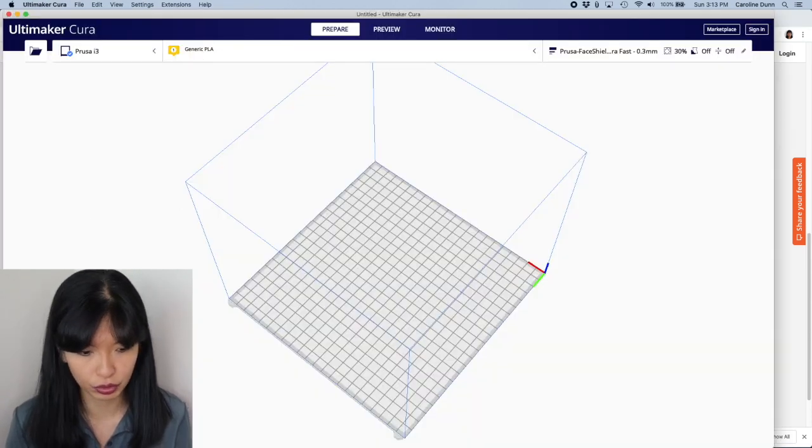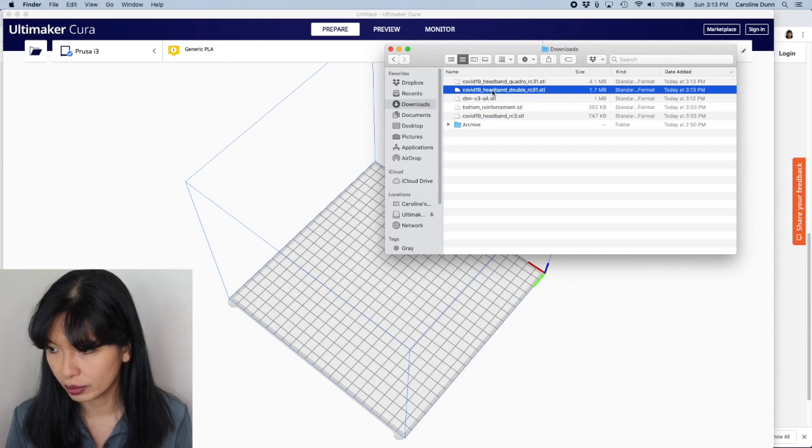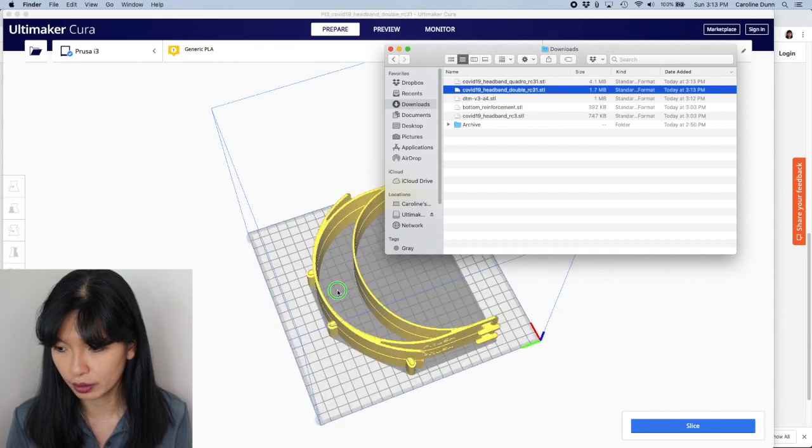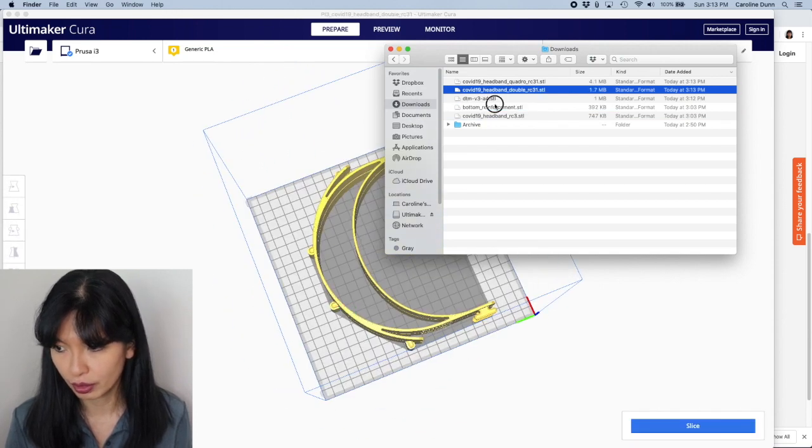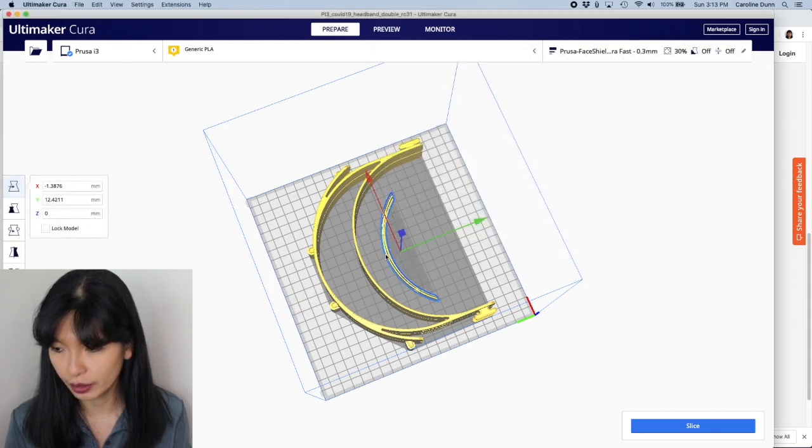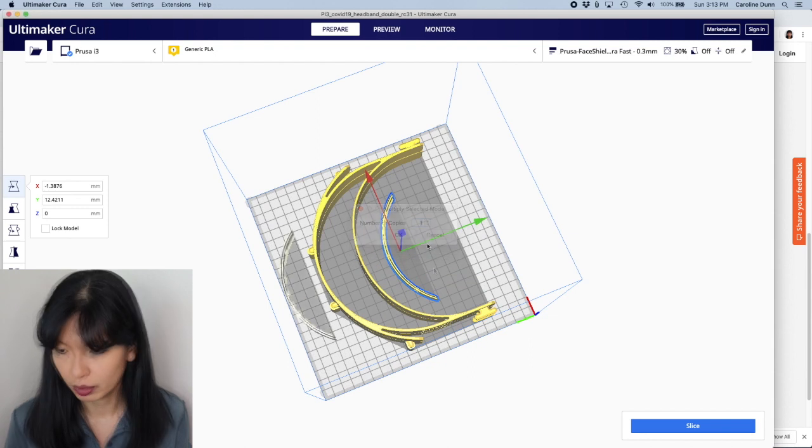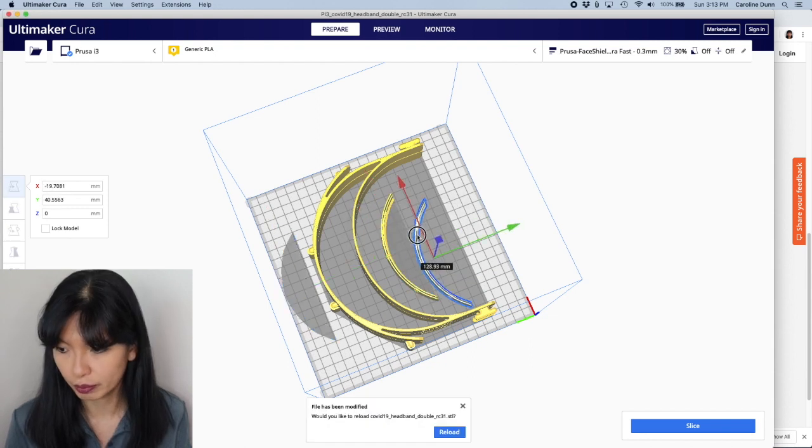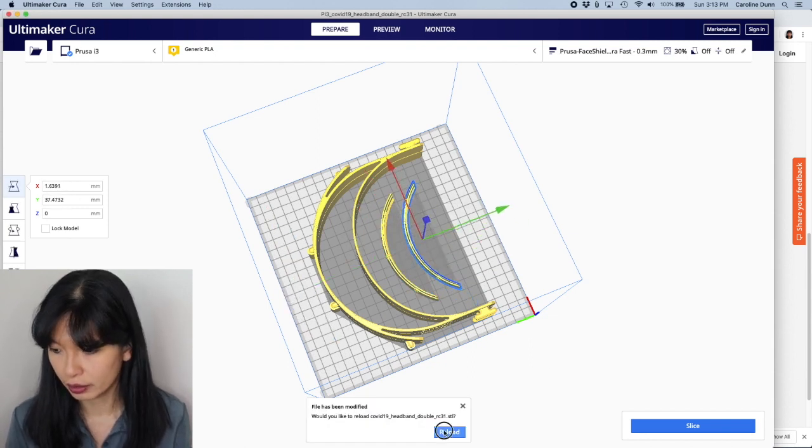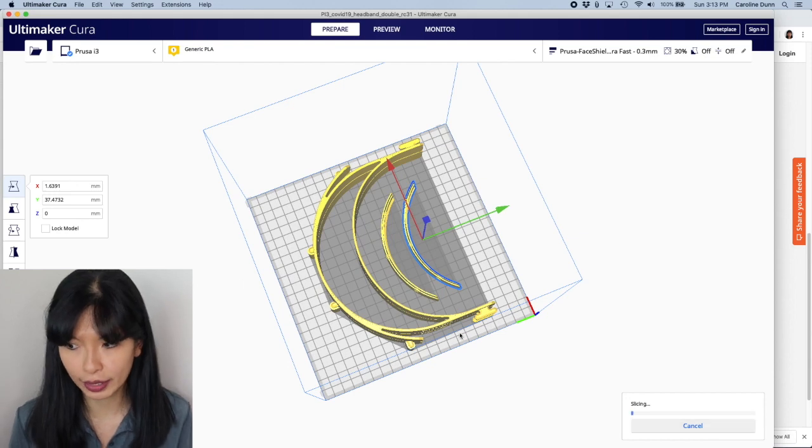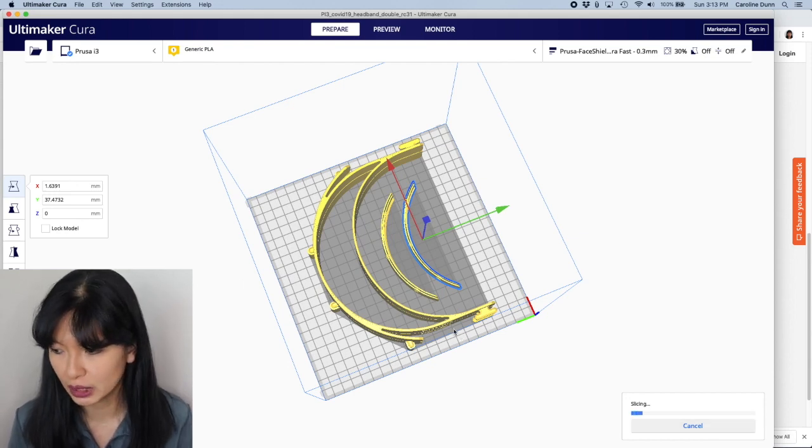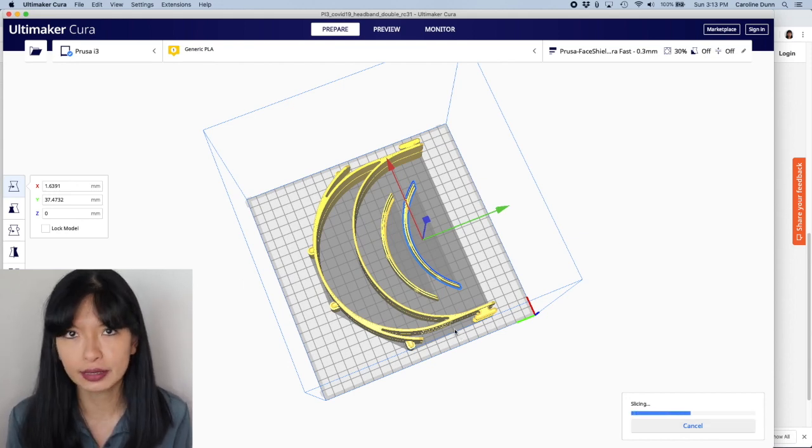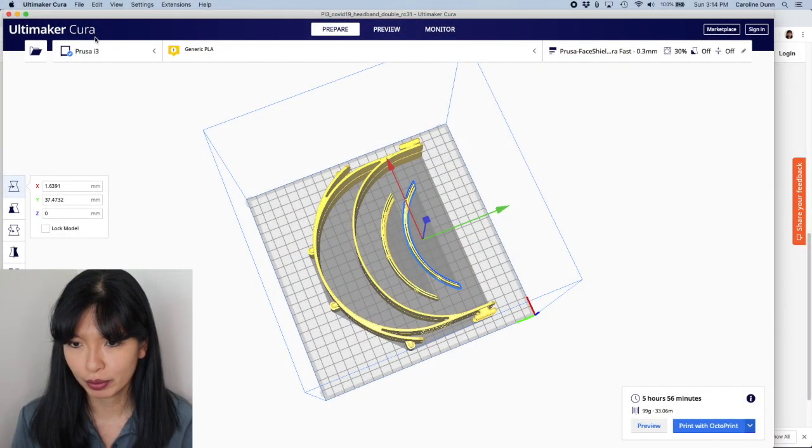To show you what this looks like, let's go back to finder. So this is the double. This is what this looks like, just to show you. And then remember to put in the bottom reinforcement. And then you probably want to multiply your model. You want to make sure everything is on the build plate right there and hit slice. And that will take a little bit longer to print as well. So let's let that slice. And then you can print with Octoprint.